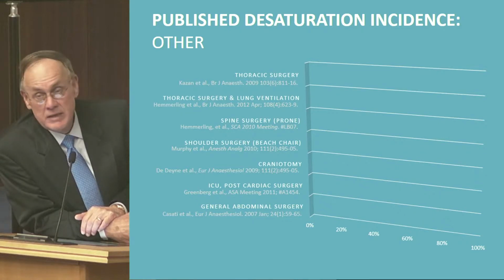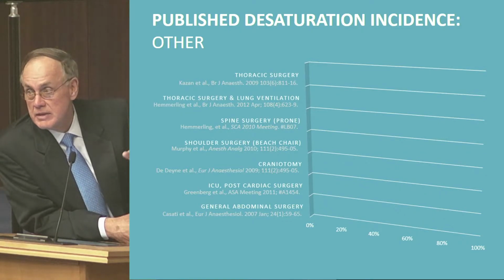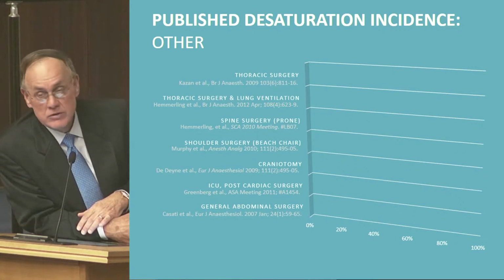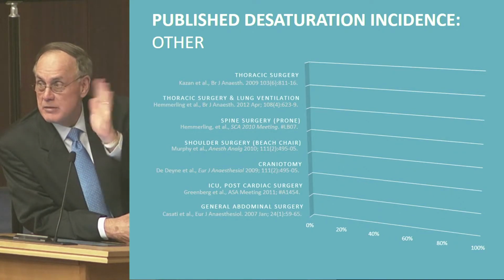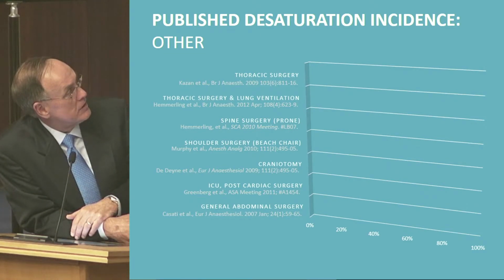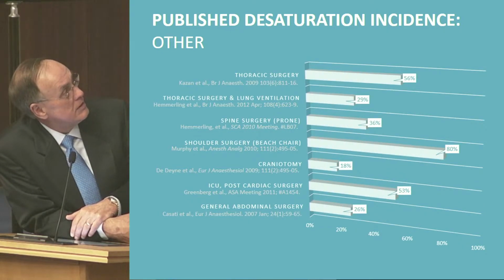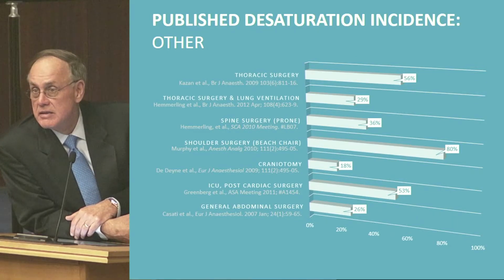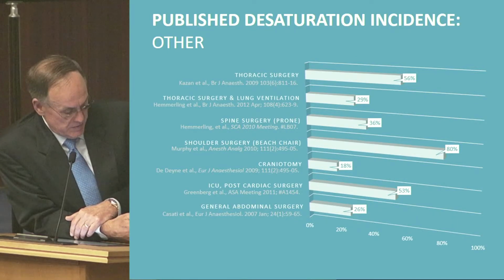We looked at spine surgery where the patients are in unusual positions. We looked at shoulder surgery in the upright sitting position, craniotomies, and also even general abdominal surgery. And again, the literature shows us that these patients do experience hypoxia during the surgeries.